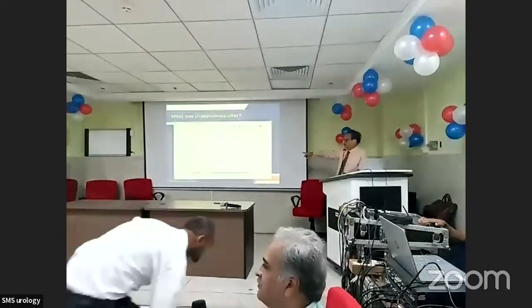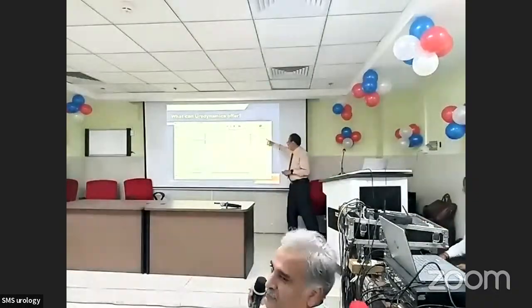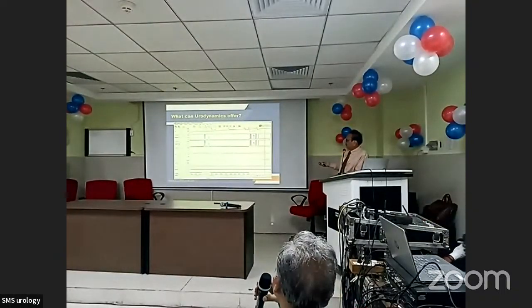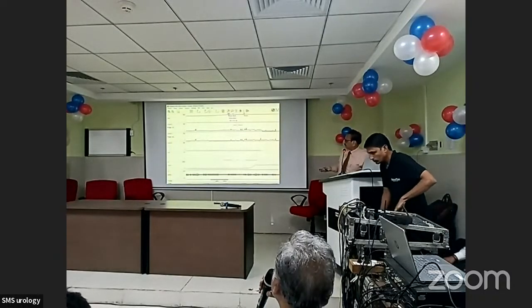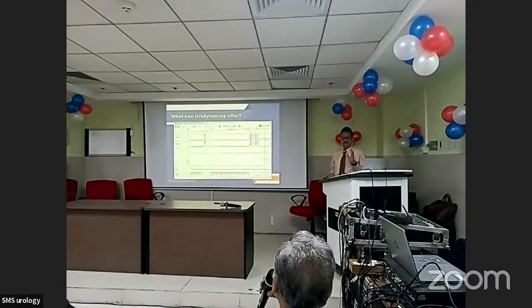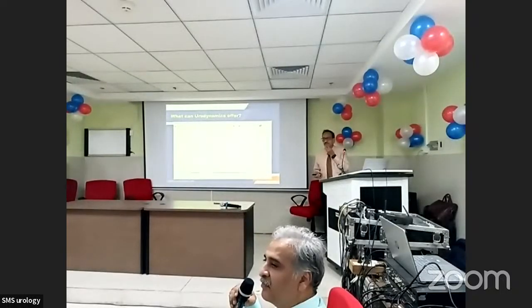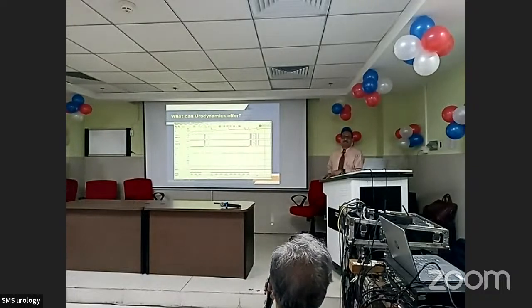You can confirm that your recording is perfect: cough before the voiding, cough after the voiding. You have done both perfectly, here also. So they are perfect. Remember, in females we don't have a prostate or any outlet resistance, so there might be no recorded detrusor contractions. Brilliant answer. Please sit down.